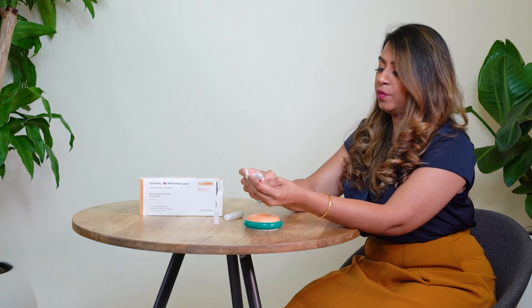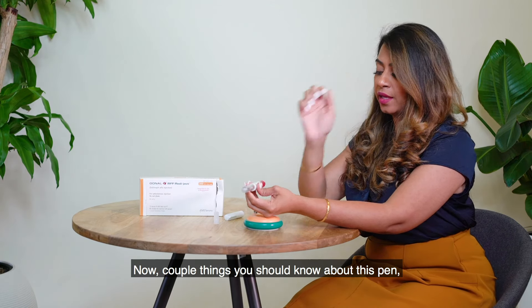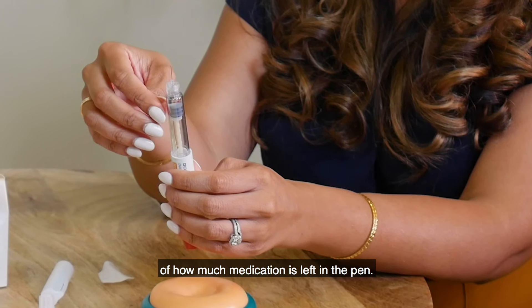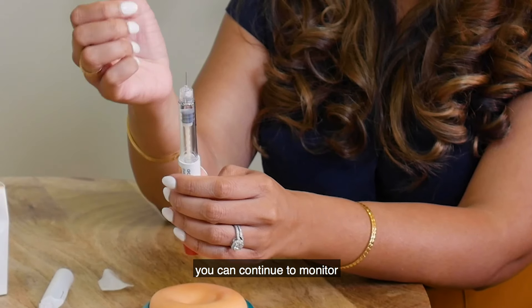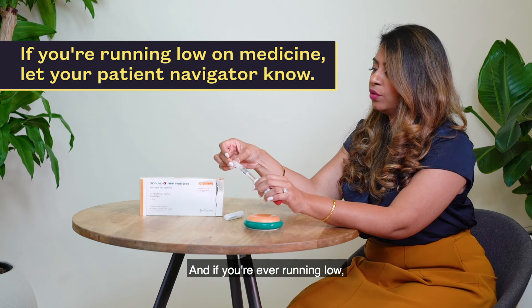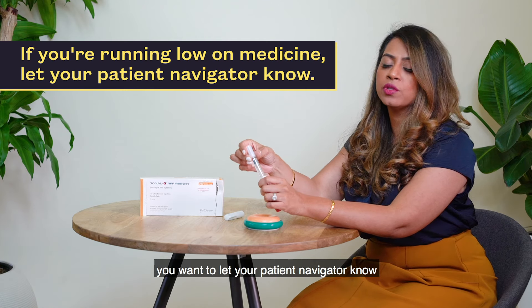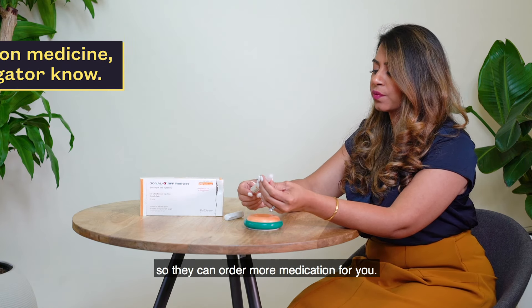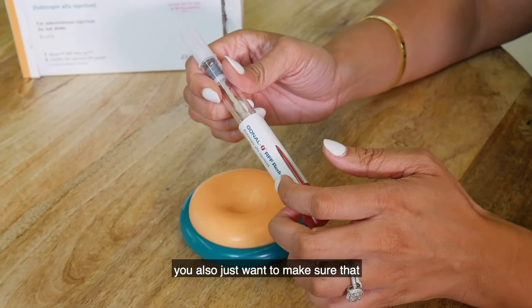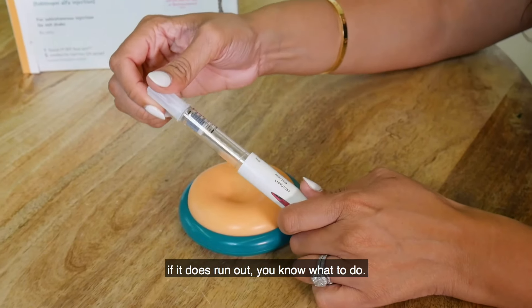A couple of things you should know about this pen: it has a counter showing how much medication is left. Once you look at the dial you can continue to monitor how much you have left, and if you're ever running low you want to let your patient navigator know so that they can order more medications for you. Even though you may be keeping tabs on this, also make sure that when you're taking the injection, if it does run out, you know what to do.